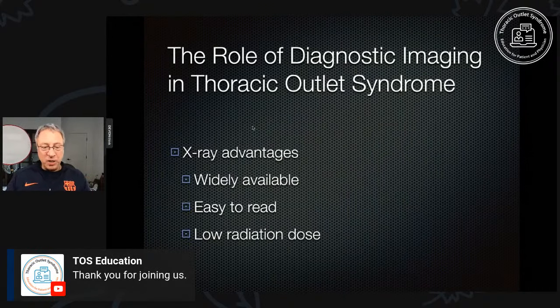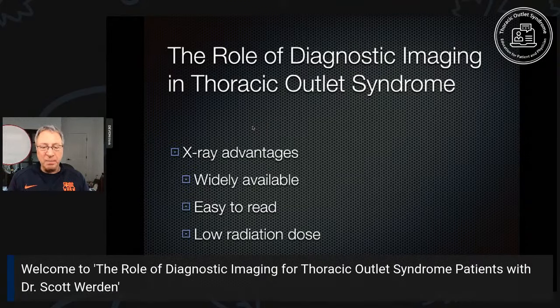It has certain advantages. It's widely available. Any hospital, many doctors' offices, they have X-rays. They're easy to read. Almost any radiologist can read them. You don't need special training. And they provide the patient with some radiation, but it's a pretty low dose of radiation.